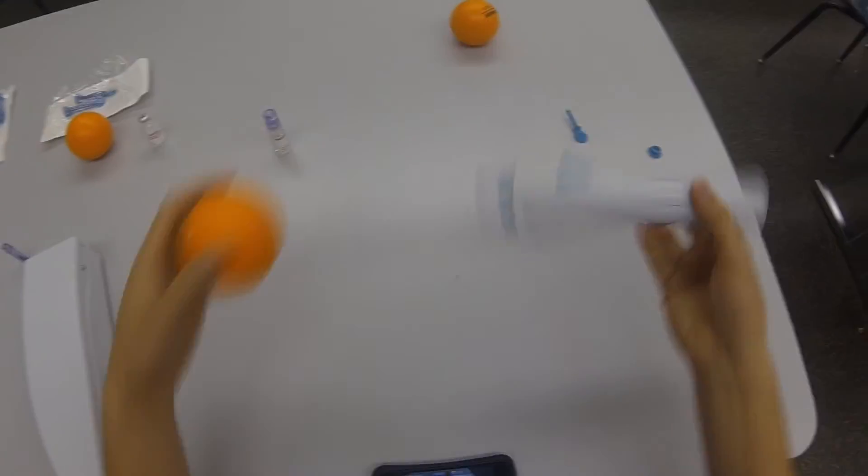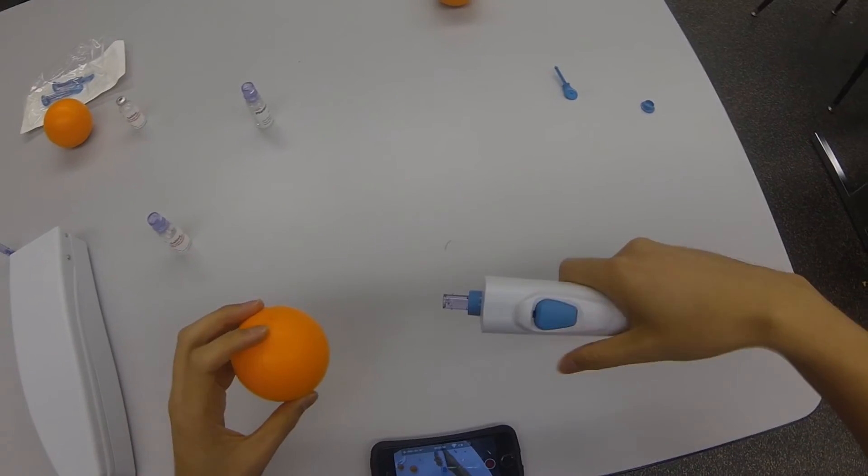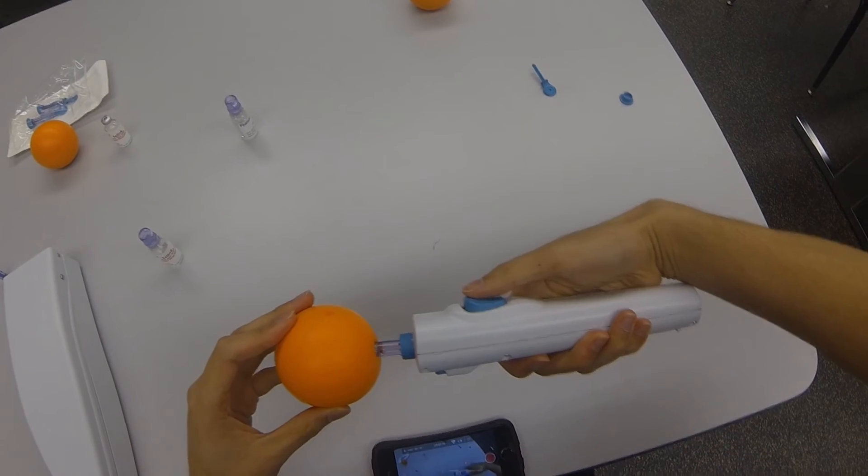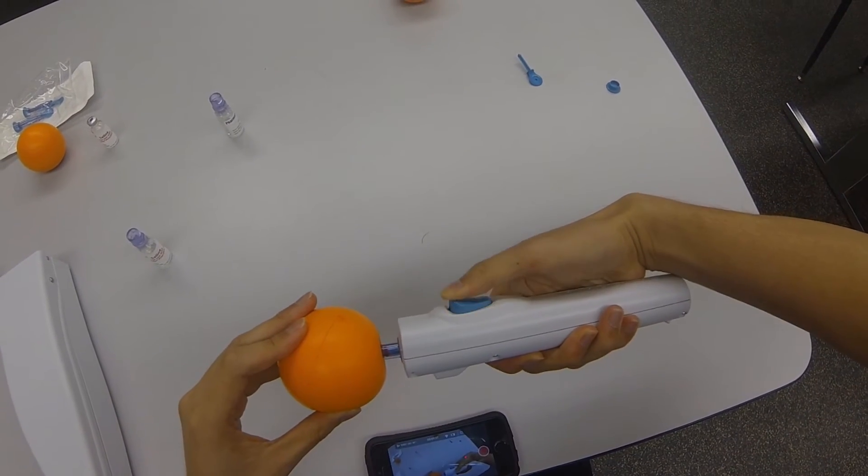Now you're ready to inject your dose. When you initially press the machine against the patient, it should be able to move freely. To apply the dose, press into the patient until the blue ring disappears. Then press the top button to inject.